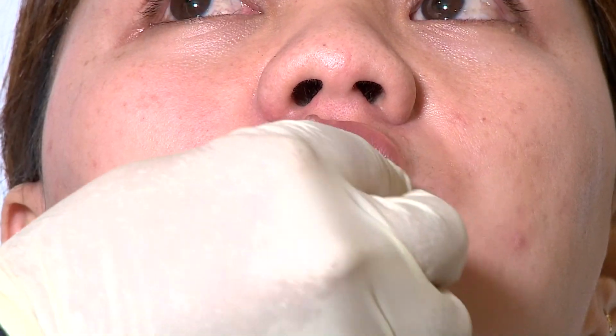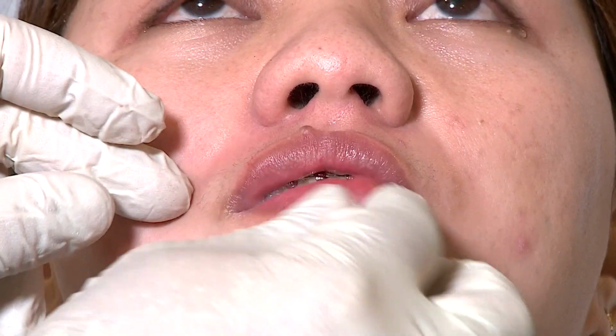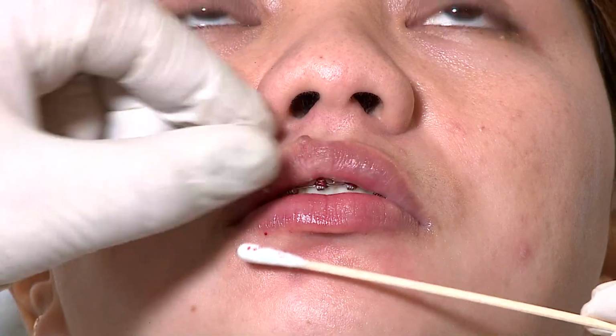As we can see here, we injected using Belotero Balance. The advantage is rejuvenation, hydration, and stretching of the lips, and also a little bit of volumizing. With this approach, we don't have much bleeding and not much swelling. That offers the patient less downtime and makes the procedure more comfortable and easier. The only post-procedure instruction you give to the patient is gentle massaging at home and to see the patient again in a couple of weeks.